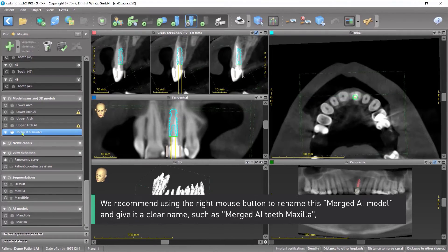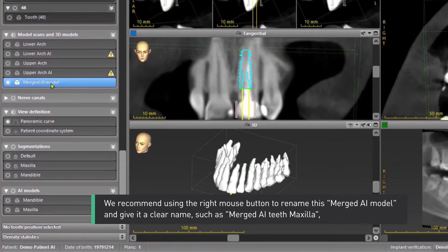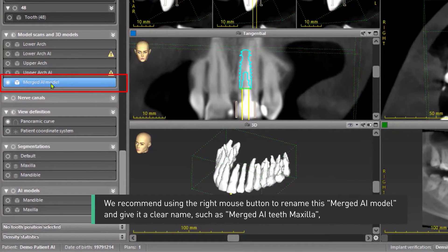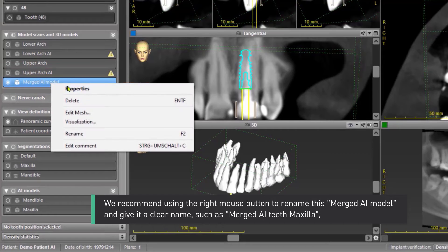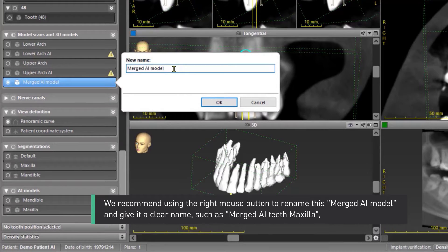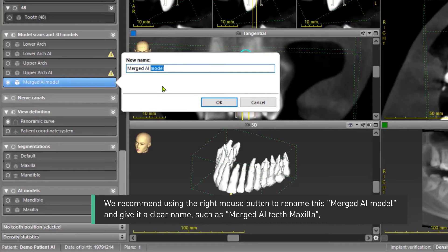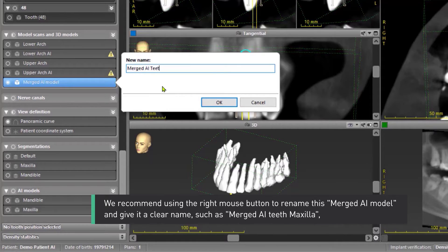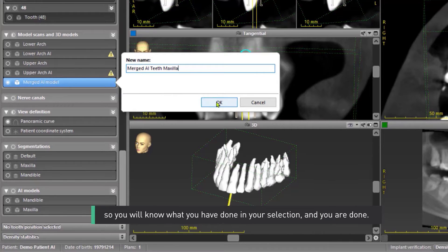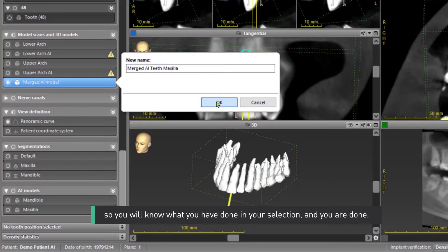We recommend using the right mouse button to rename this merged AI model and give it a clear name such as Merged AI Teeth Maxilla. So you will know what you have done in your selection and you are done.